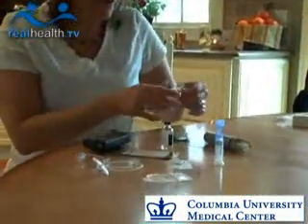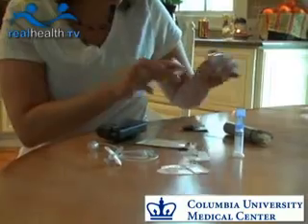The catheter, which always has a little bit of insulin going in, actually usually gets a little old after about 2 days. Either it becomes a little bit obstructed or the insulin doesn't work as well. You can get a little kink in the catheter. So we strongly encourage everyone to change that catheter every 2 days or so.